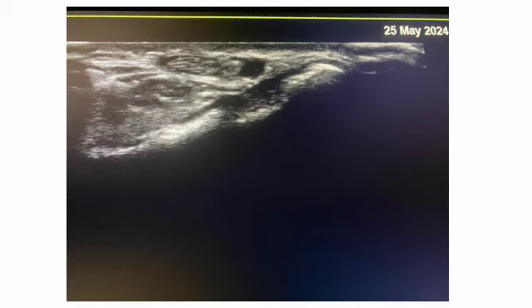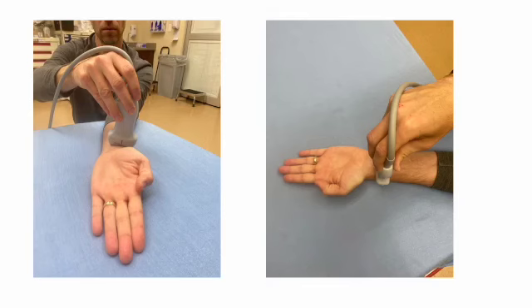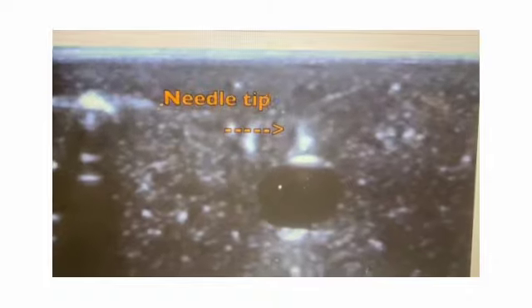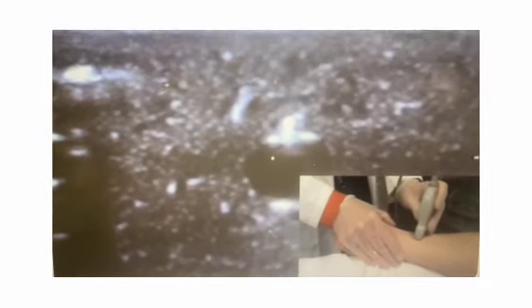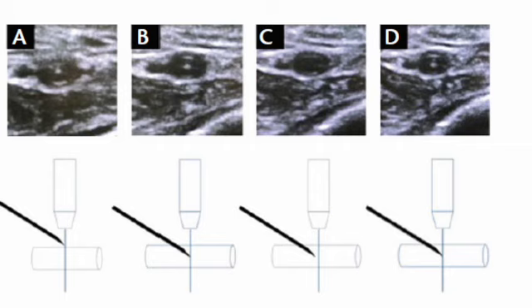This is what it looks like. I've got the artery dead center next to a tendon — this view is actually too deep. We're going to zoom in and put the center marker on to line everything up, then decrease the depth to about two or three centimeters total. The technique is transverse, about three centimeters up from the wrist crease. In the ultrasound video you can see the needle tip — the white flashy line — coming straight down. As you move the probe slightly up you might lose the tip, then you advance the catheter a little further until it hits center.